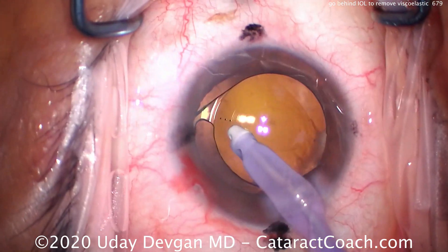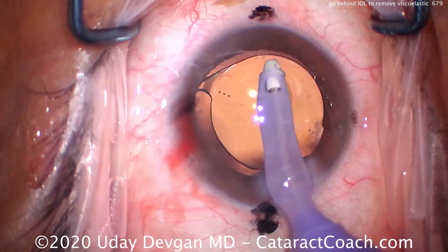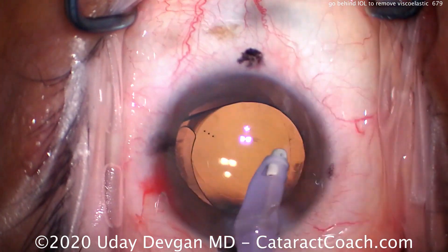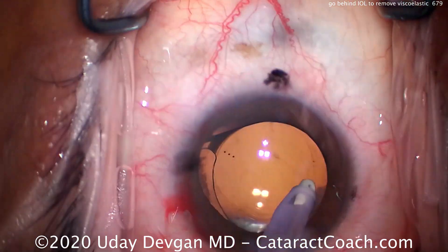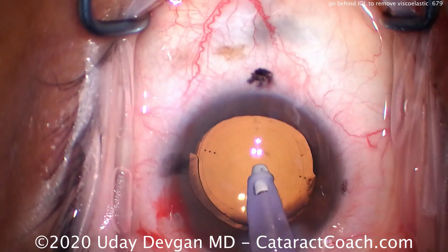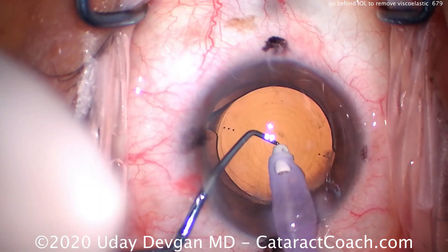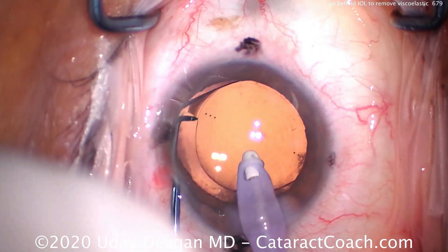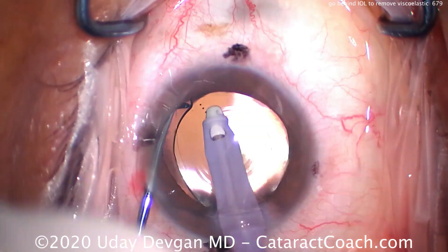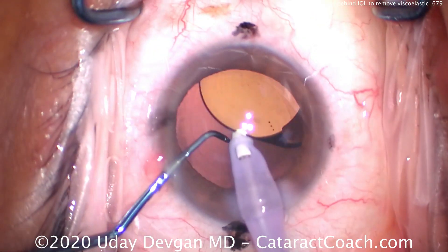Here, you look at the video — another trifocal toric IOL that has to be placed at a very specific axis in terms of rotation, and we also have to center the diffractive rings with the Purkinje images. So in this case, it's absolutely critical that you remove the viscoelastic from behind the optic. If you're going to do a toric lens, a diffractive lens, a multifocal lens, or a toric multifocal lens — all of those require that you remove the viscoelastic.